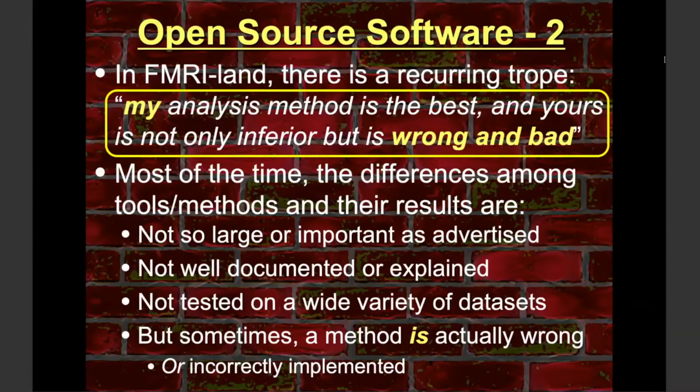They were doing for resting state fMRI, they would bandpass their data, so to remove the frequencies of no interest, the high frequencies, say, that are not thought to be bold effects. So now they have the bandpass data, and then they would project out other regressors of no interest, like the motion parameters and stuff. This is wrong. This is dead wrong. And people had published a lot of papers doing that.